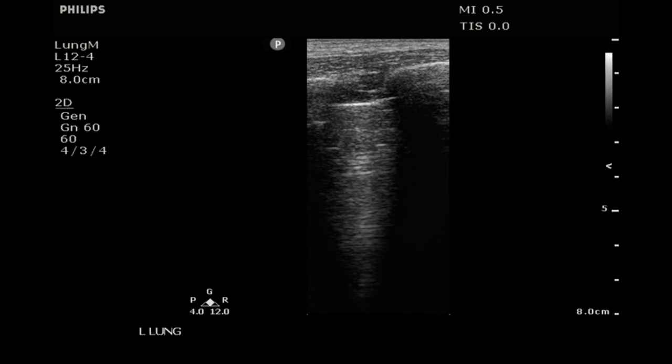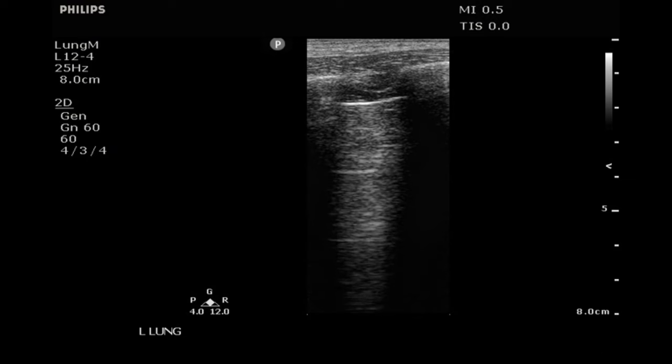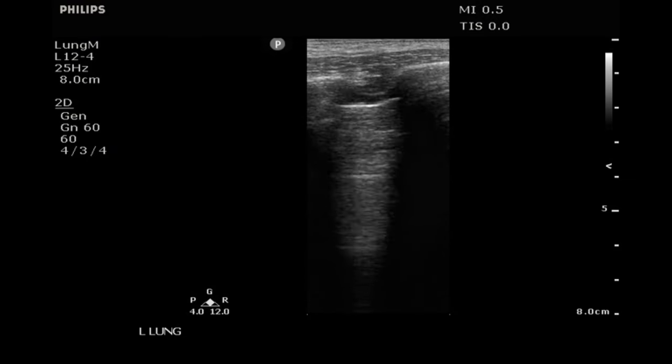And so those are the three things that we're going to look for in pneumothorax as we go through this whole decision tree of, do they have lung sliding, yes or no, right? And I'll put up some more images on the YouTube channel so we can look at those later. But the second column of things that I want to look through is called the evaluation of interstitial syndrome, right? And so this is that A profile versus B profile, right?